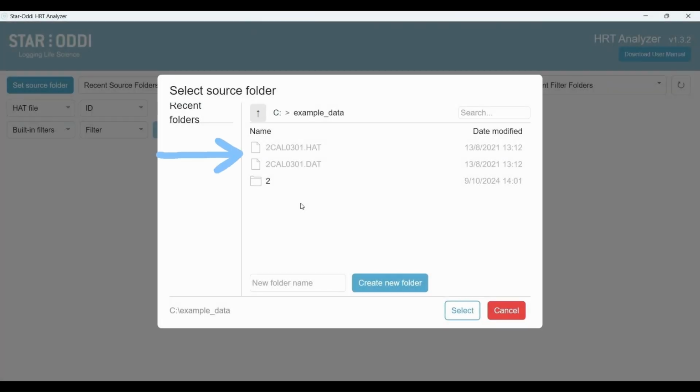These are converted files based on what you have done inside Mercury, like quality index elimination. You can find older conversion files inside the sequence number folder. In this case, I have only the original file, which is marked with 0 in the beginning. However, if you previously reconverted the data in Mercury, you'll see those files here as well.